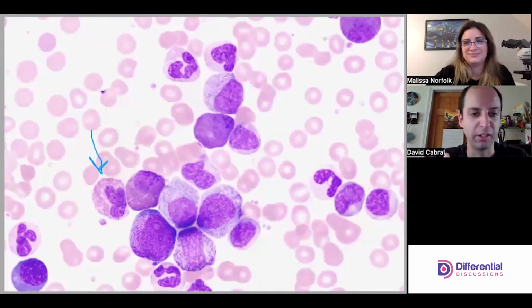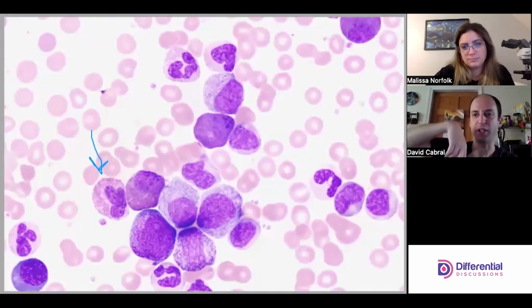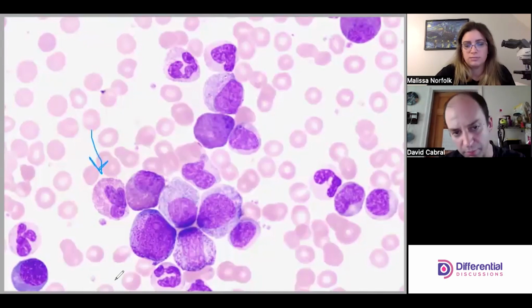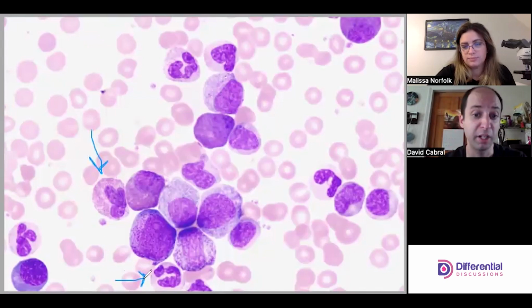So it looks like a neutrophil. Yep, the nucleus is kind of folded in on itself, but we see pretty clear lobes. Granulation's consistent. I'm satisfied with the neutrophil call there. Me too. And this one, probably also. Maybe we could call all of them, we get a bunch of neutrophils. Yep.